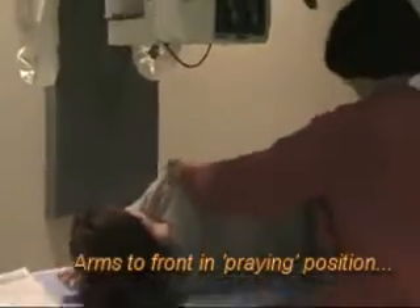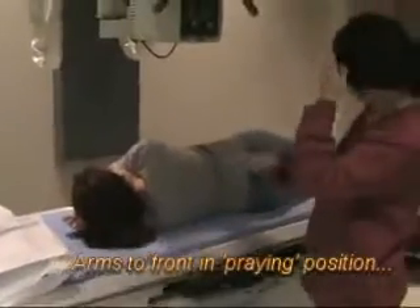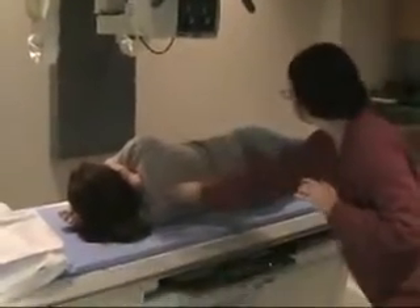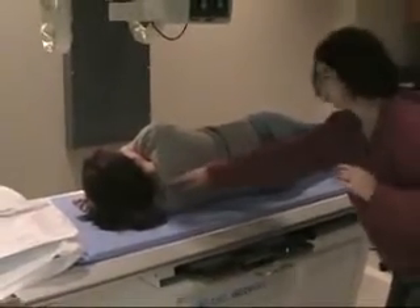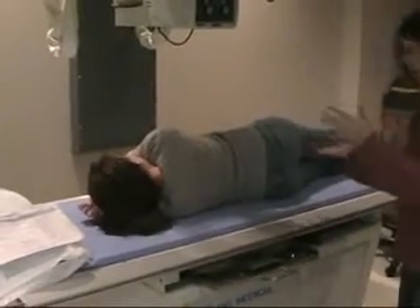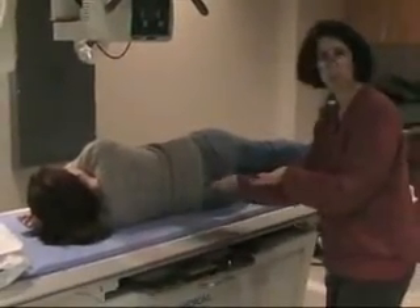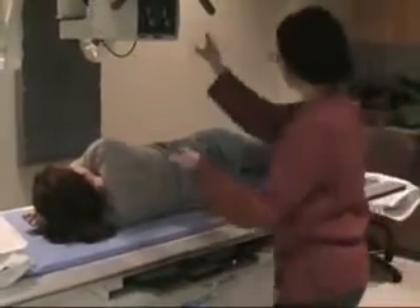The important thing with all of these spine views, once we get to the laterals, is that the spine be parallel. Hers is close so we don't have to do anything, but a lot of people — if you've got big shoulders or big hips — it's going to make it hard to be parallel. So you might have to put some support or build it up to make the whole thing parallel.